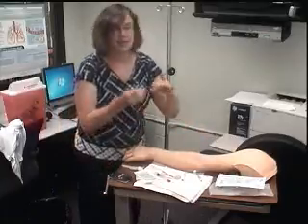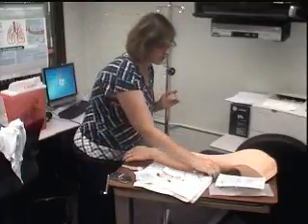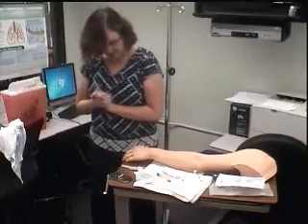I would also bring in a little scrubby hub thing, so when I actually go to hook up my IV fluids, I'll scrub the hub before I actually hook it up. And I'm trying to think if there's anything else. I mean, of course, there's going to be a needle box in the room.